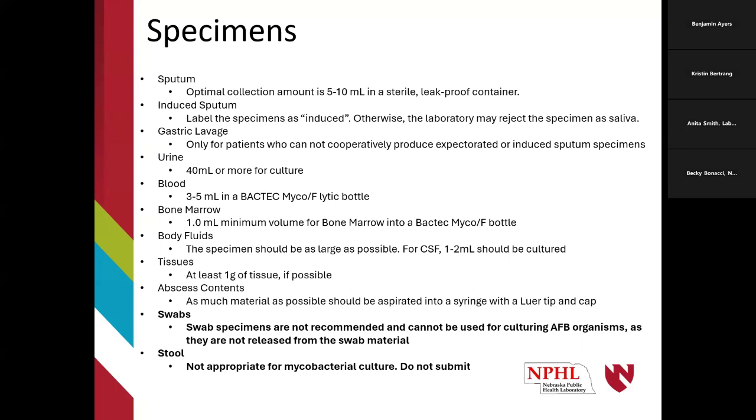One of the things that we always ask is to make sure that we get actual specimen. Swabs are not recommended, and we usually will reject those due to some of the unique qualities of mycobacteria. Swabs are not good or sufficient material for culture.